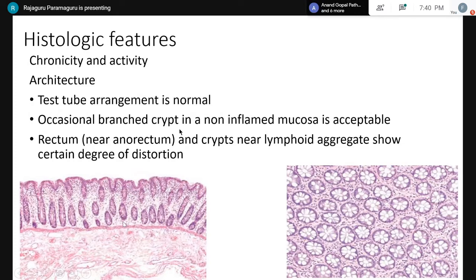When it comes to an infective colitis, the plasma cells are going to get increased only in the top layers, and in the basal layers this gradient will be very well maintained in an infective or a resolving infective colitis. Whereas when it comes to chronic colitis, this gradient will be lost, so that the plasma cells will be denser even in the lower third.